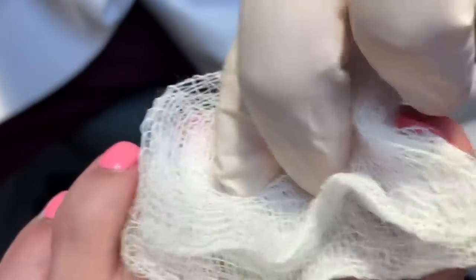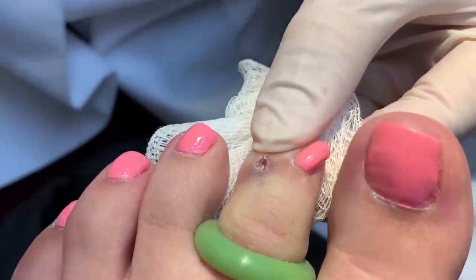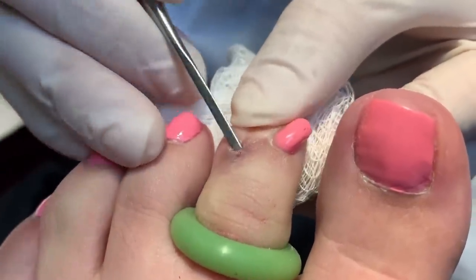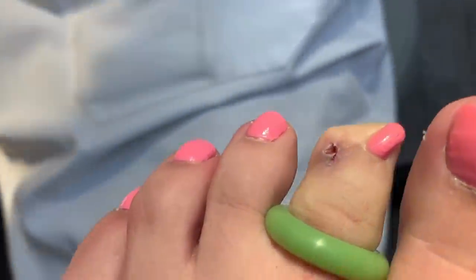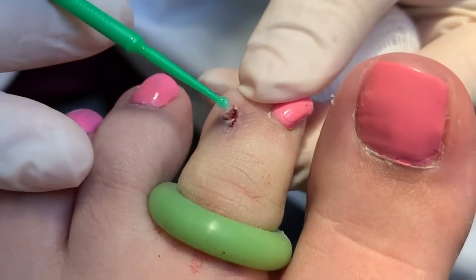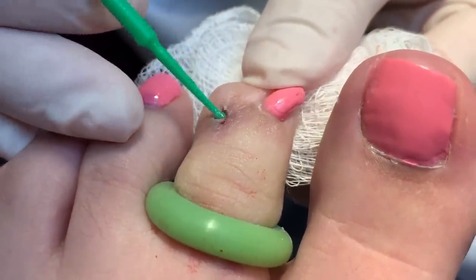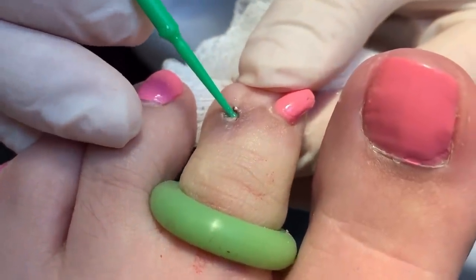Make sure that whole thing comes out — then we do that one time. I want to make sure that we have everything cleared from there, in case some of the tissue is left over, which was cleared. So we're going to go for the second application. I'm glad to have this very small applicator here to get into this area and burn the matrix so that it won't grow back anymore. So about 30 seconds application here.